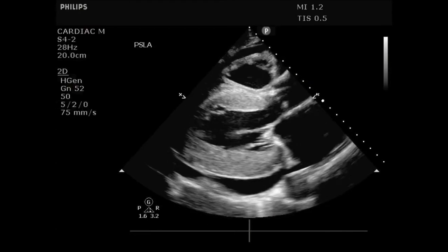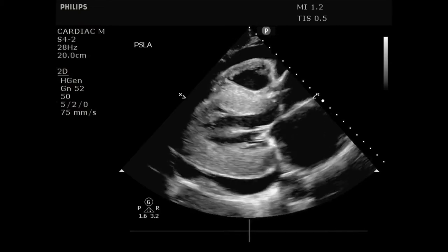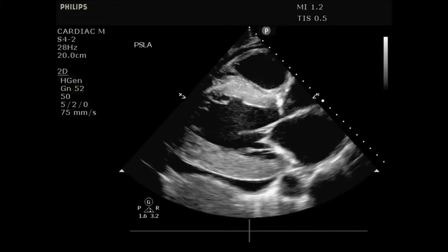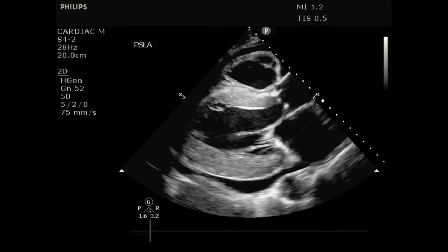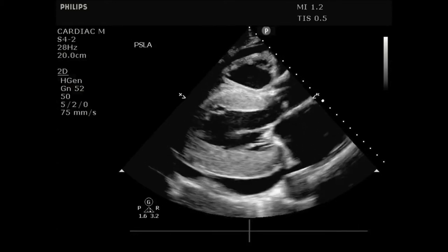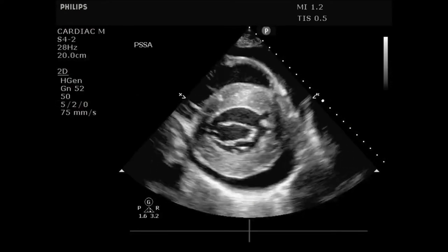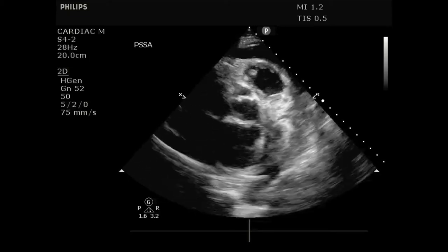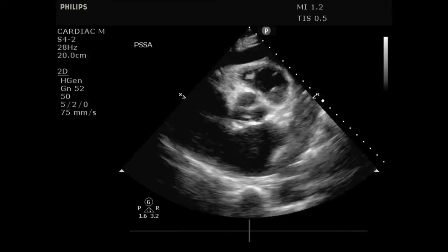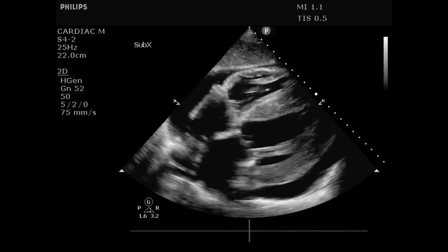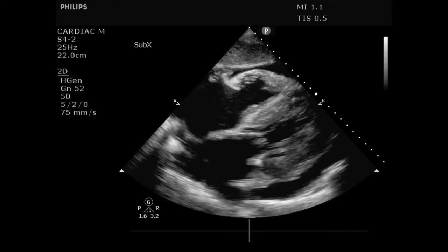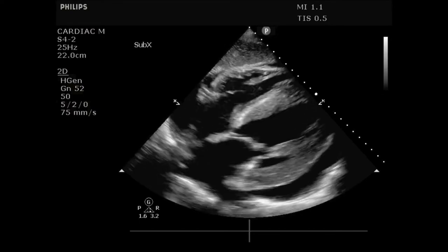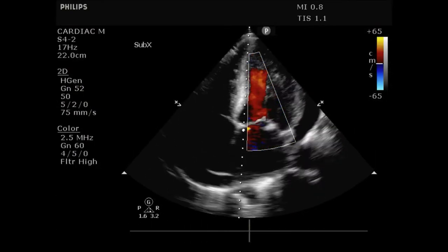When they get too large, pericardial effusions can be quite prominent and hard to miss — a very large effusion with a thickened appearance. Other windows are also helpful: the parasternal short axis, going 90 degrees off the parasternal long, gives a 'donut view' of the heart where you can also see the effusion collecting. In the subcostal window, you can see the effusion in the gravity-dependent area and wrapping around to the superficial areas as well.